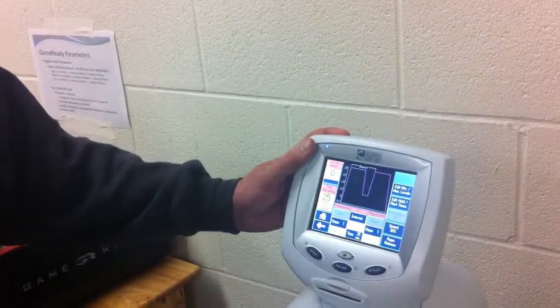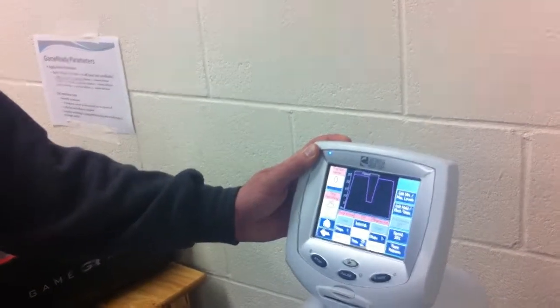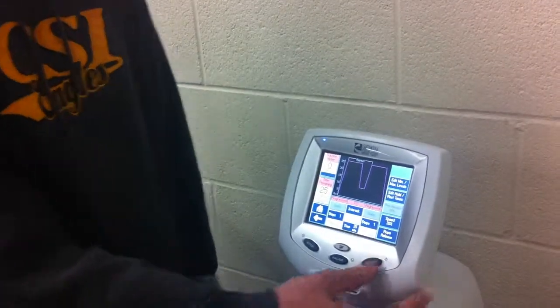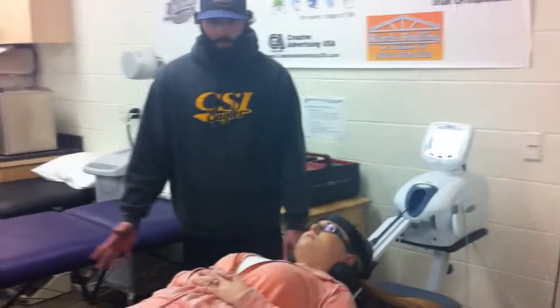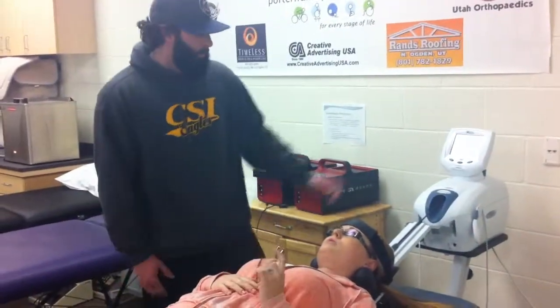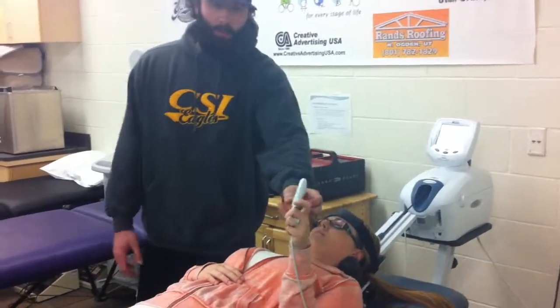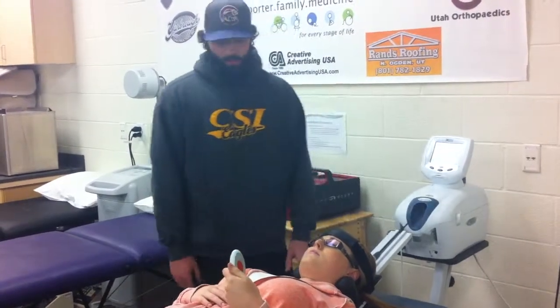Once we are there, we want to make sure and look over all of our steps to make sure we are in the right place. And once you are ready to start, you're going to hit the start button, and that is going to start your treatment time. And then just monitor your patient throughout the treatment, make sure they're comfortable. You also want to give them a kill switch. They have a kill switch that they can push at any point. If they feel uncomfortable, they can hit it and it will stop the treatment altogether.